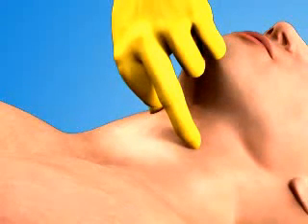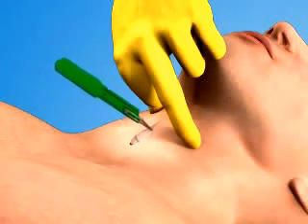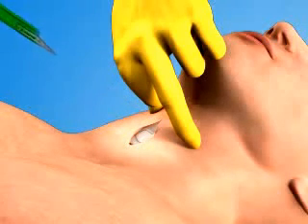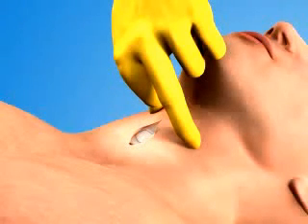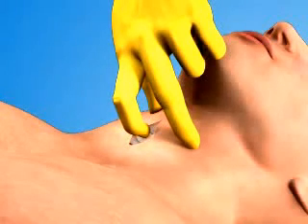Use the 11-blade scalpel to make a 2-3 cm vertical incision through the skin and subcutaneous tissue overlying the cricothyroid membrane. Use the index finger of your non-dominant hand to palpate the membrane through the incision.